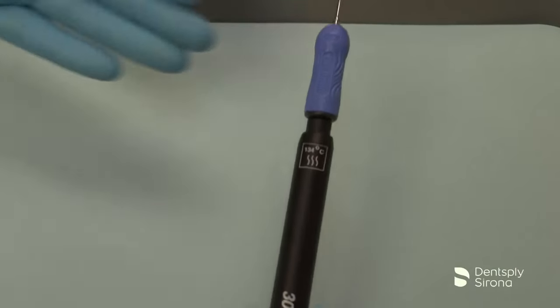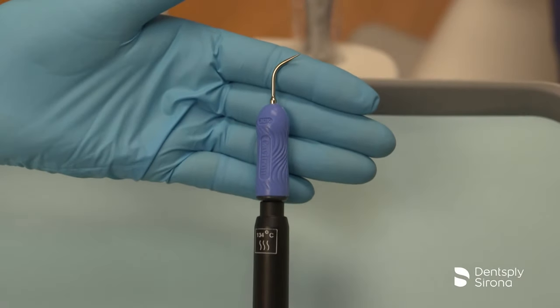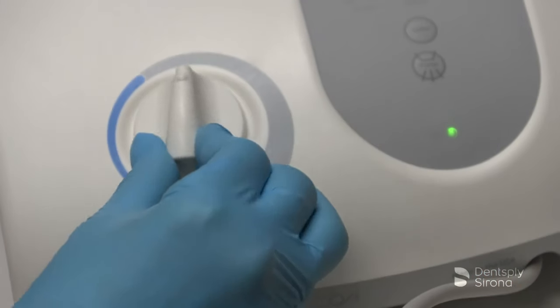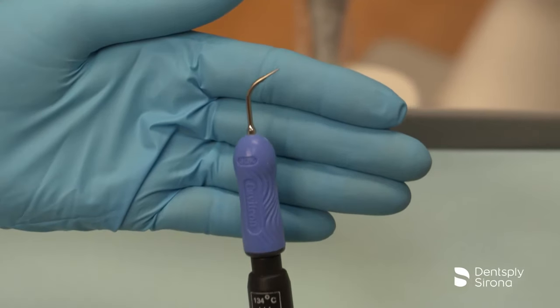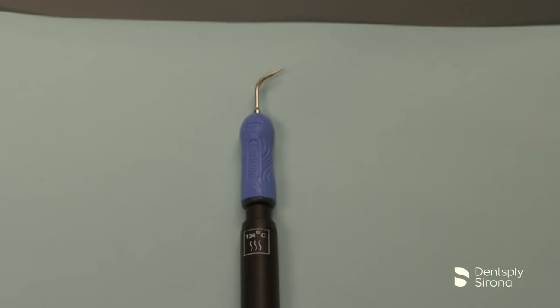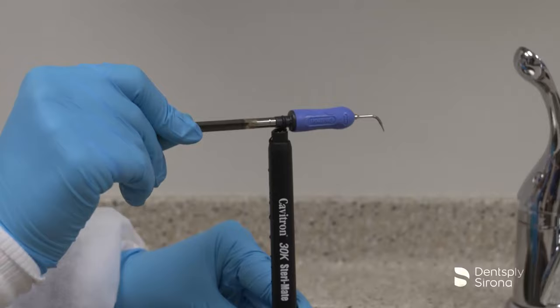This is the Cavitron FSI-10. It is designed for removal of moderate to heavy deposits and can be utilized at all power levels. The Cavitron FSI-10 has a straight shank and can be used on all accessible tooth surfaces.